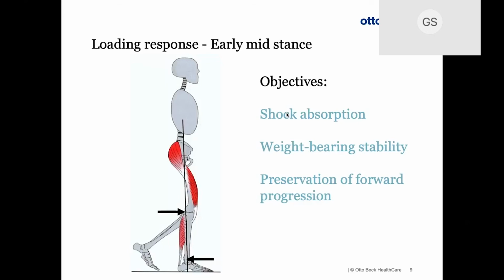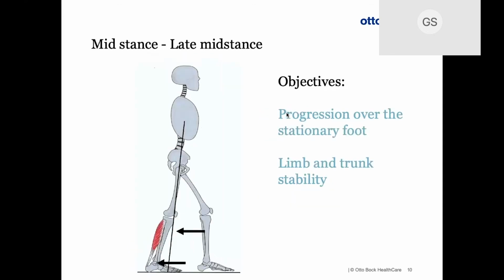The anterior tibialis fires to eccentrically control the plantar flexion. And so we're really trying to provide this absorption of that impulse shock through the whole body. While this is happening, the anterior gluteus might appear to be eccentrically lengthening, but it's moving the hip joint into internal rotation and stabilizing the system or the upper body for weight acceptance.